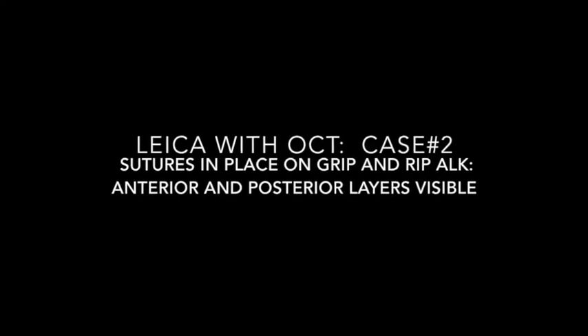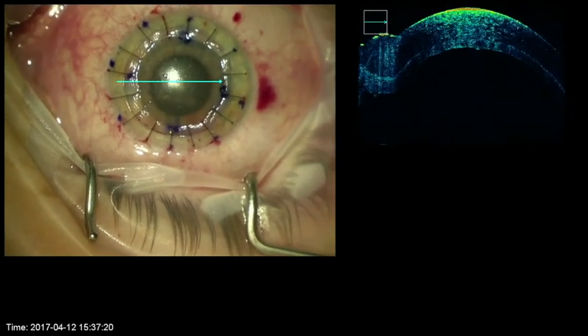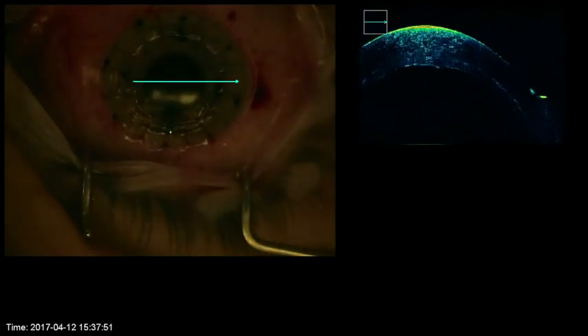In this case, the grip and rip ALK has been completed and the posterior lamellae of approximately 100 microns is visible. The OCT image can be somewhat enhanced when the microscope light is turned off.